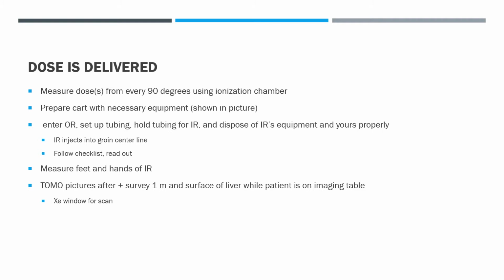You have to be really certain, even how you measure it, right? So instead of using the Geiger-Müller, they use an ionization chamber, and they put the dose.